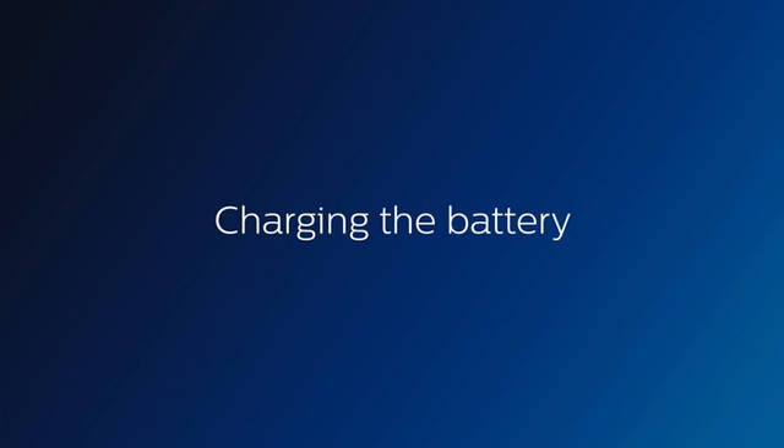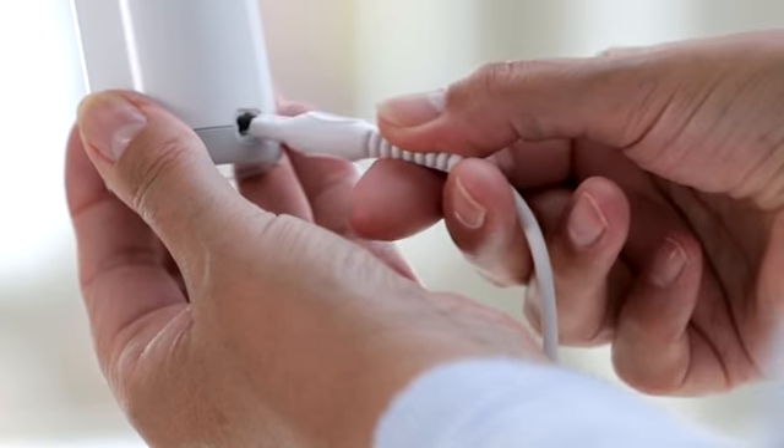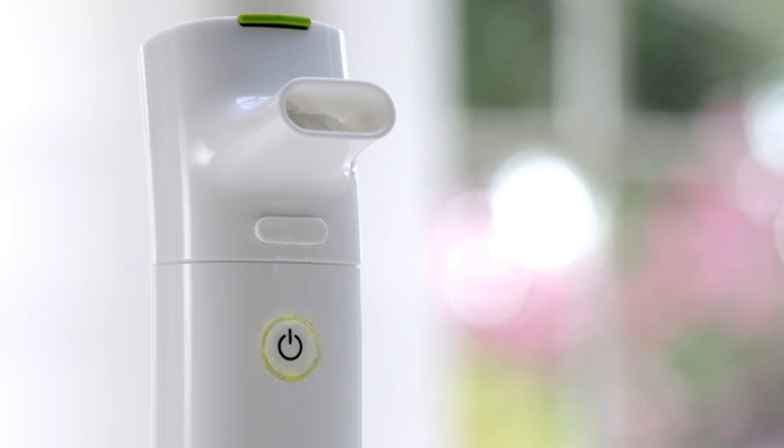Charging the battery. Simply connect the power adapter to the socket on the back of the nebuliser handset and then plug the other end of the adapter into a wall outlet. The LED light on the nebuliser will pulse green while charging. Continue to charge the battery until the LED stops pulsing and turns solid green, indicating it's fully charged.